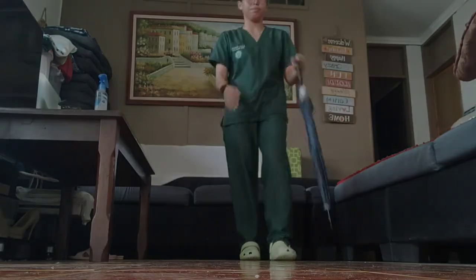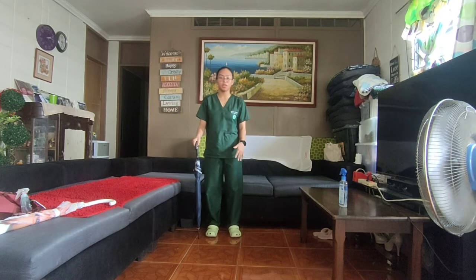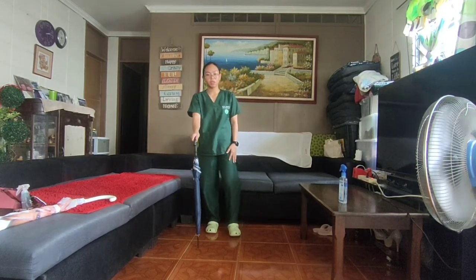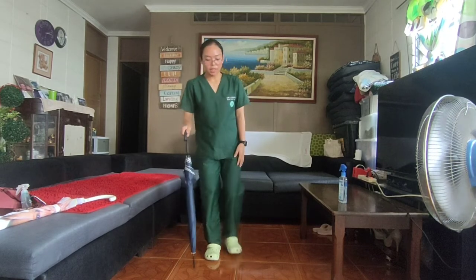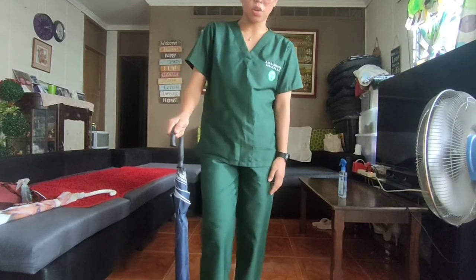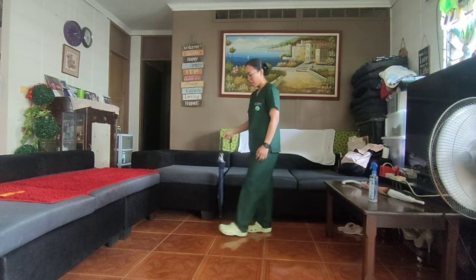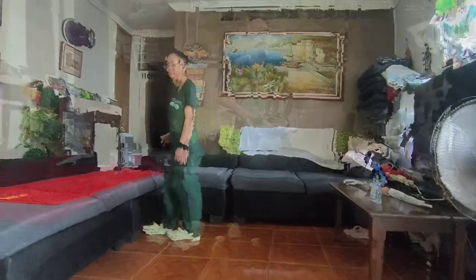Let's demonstrate the cane gait. Assuming this is the weaker side and this is the stronger side: instruct the patient to move the cane forward and advance the weak side simultaneously, then follow with the strong side. The pattern is: cane and weak side together, then strong side — repeated throughout ambulation.